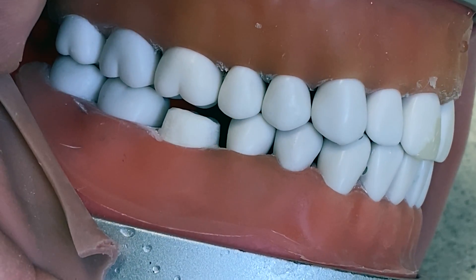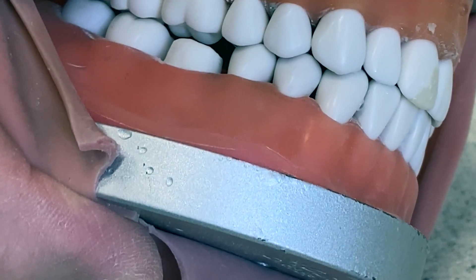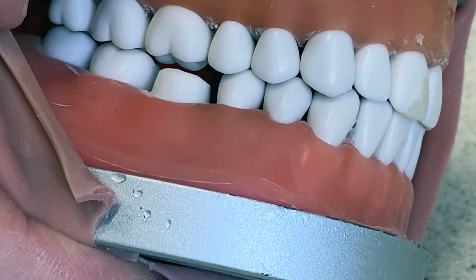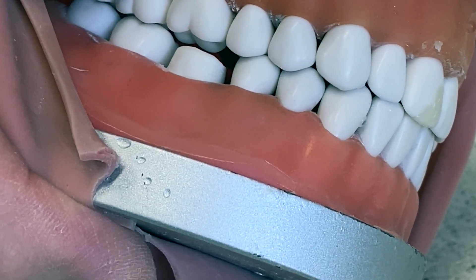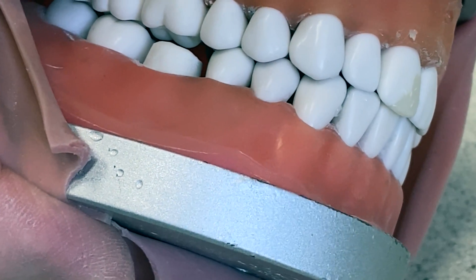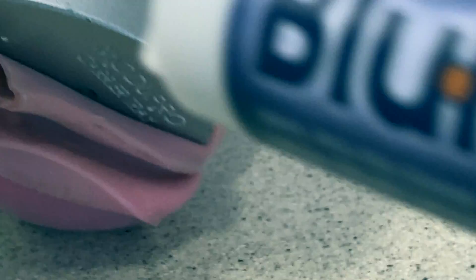So without further ado, I'm going to show you what we do. Here I have a generically prepared tooth prepared for a crown — could be gold, could be porcelain, very generically. This is a typodont, so it's of course nobody's real mouth or jaw — generously provided by a dental student at Temple University who is entering his second year. We're going to show you how to basically get this bite registration with one method. I'm going to be using a material called Blueprint — some people know it as Blue Moose. Here is the Blueprint and the syringe that we use.